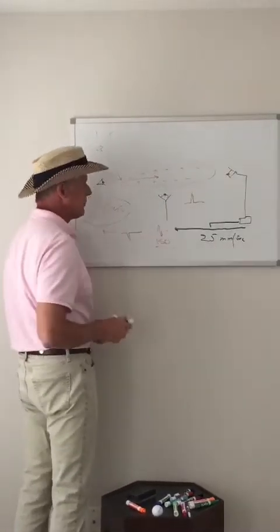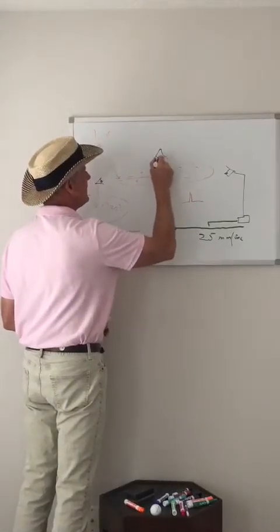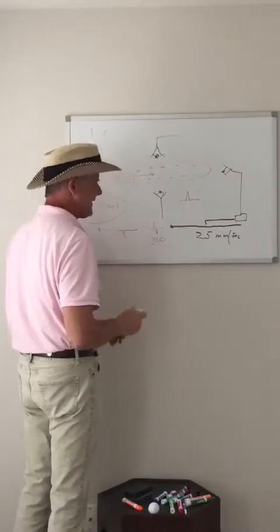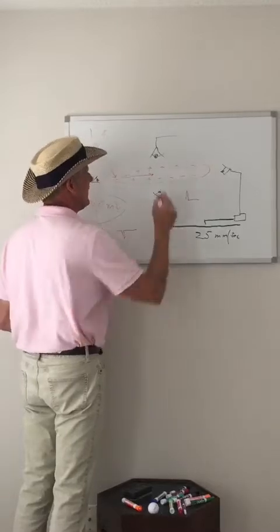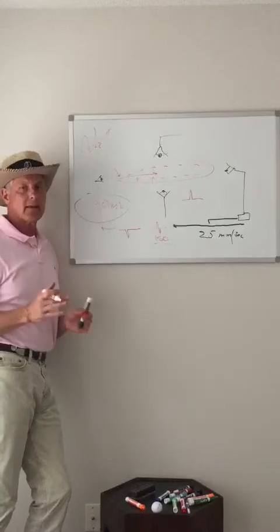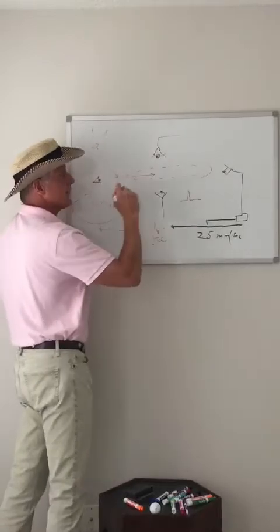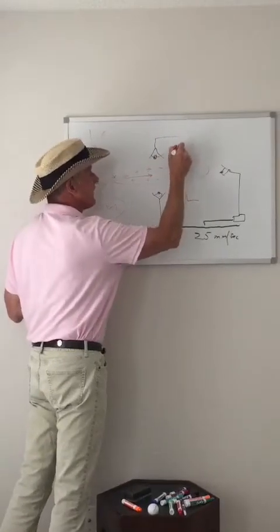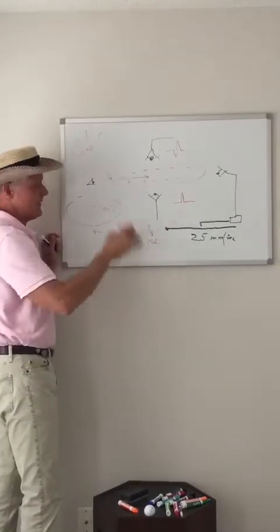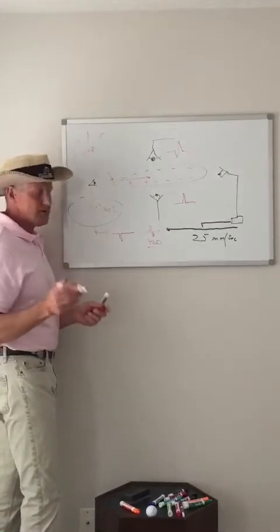So from that, you can predict that if I were to put a lead here and hook it up, it would record a deflection that indeed is isoelectric, because it's seeing a wave of depolarization that is perpendicular to its location, or its eyeball. So it records an equal down, equal up deflection like this. It doesn't matter that it goes up and then down or down and then up. It's isoelectric, equal either way. So that's what an EKG machine is doing.